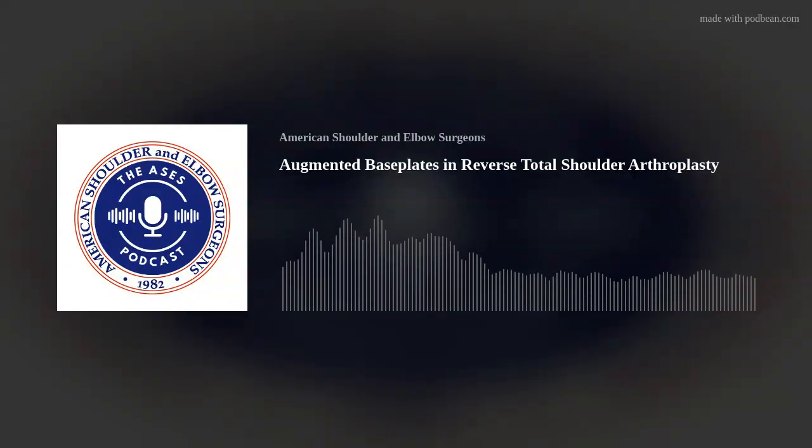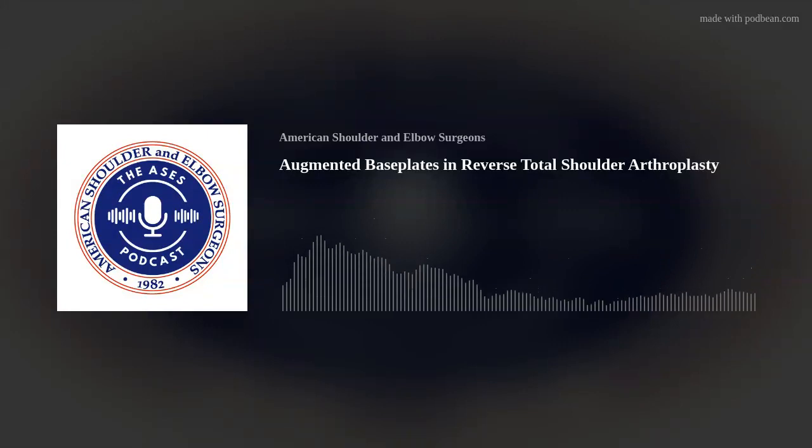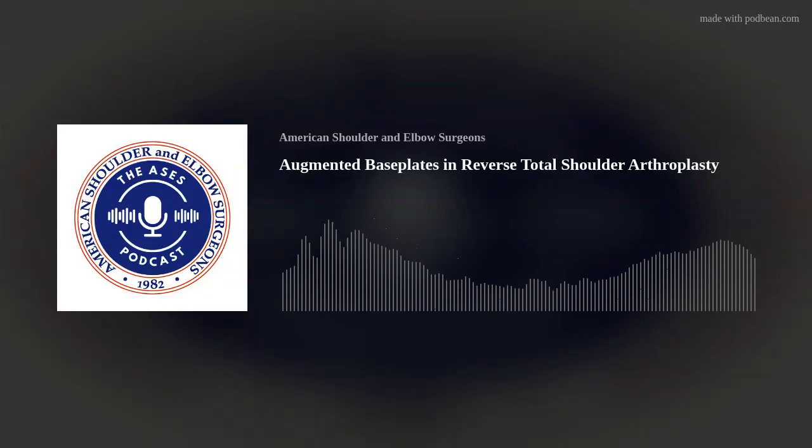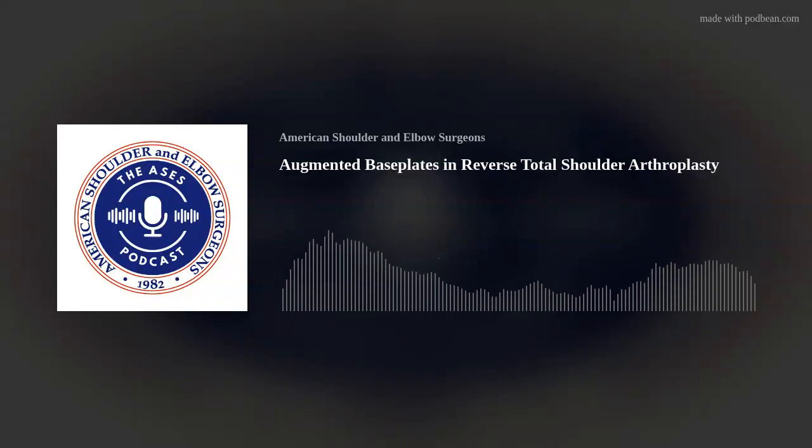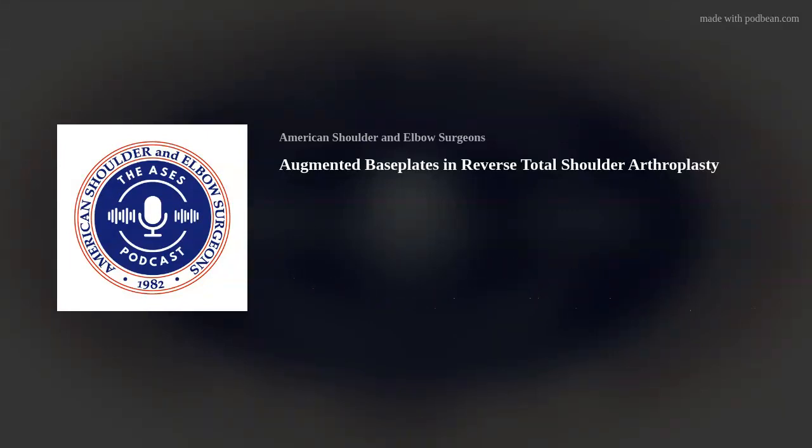Well, the premorbid joint line developed over presumably at least a decade or so. So it's been a gradual change in the length-tension relationship with the soft tissues. So I think realistically, going back to the premorbid joint line is a bit unrealistic, or puts a lot of tension on the soft tissues, not the least of which are the nerves. So to me, going back to the premorbid joint line in those situations probably isn't realistic. I think what you're trying to do is establish a good length-tension relationship to create good moment arms for the supporting musculature without putting too much stress on the scapula and the acromion.